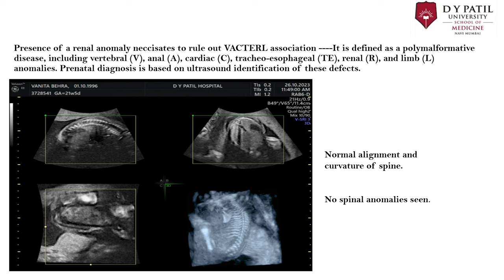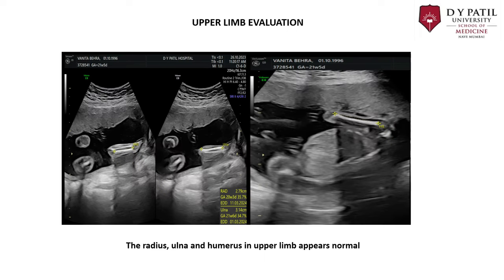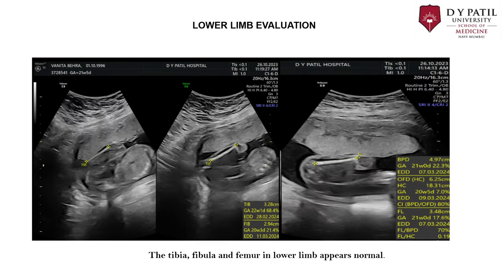Renal anomalies may be part of VACTERL syndrome, which needs to be ruled out. VACTERL syndrome consists of vertebral, anal, cardiac, tracheoesophageal, renal, and limb anomalies, with prenatal diagnosis based on ultrasound identification of these defects. The vertebral body shows normal alignment and curvature with no spinal anomaly seen. Upper limb evaluation shows radius and ulna; lower limb evaluation shows tibia and femur. All limbs are present and show normal length.